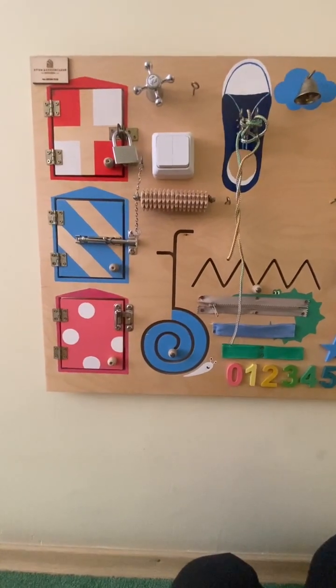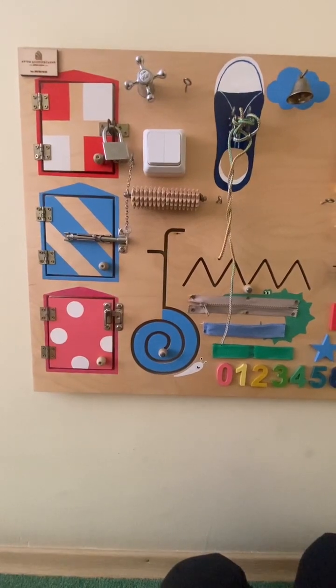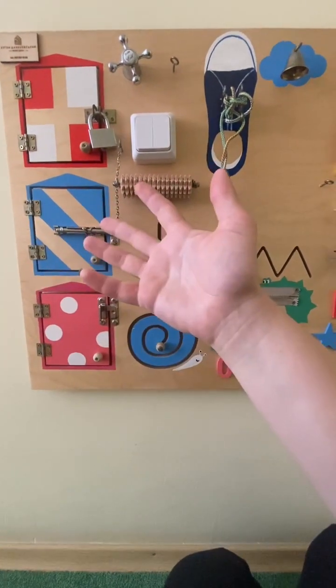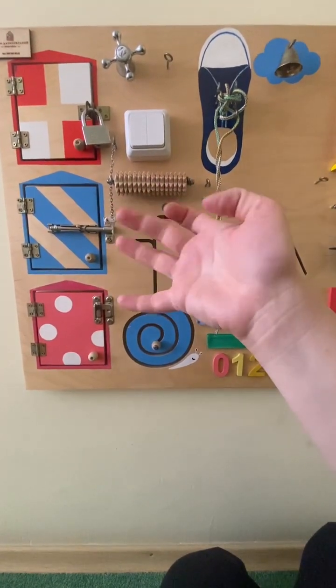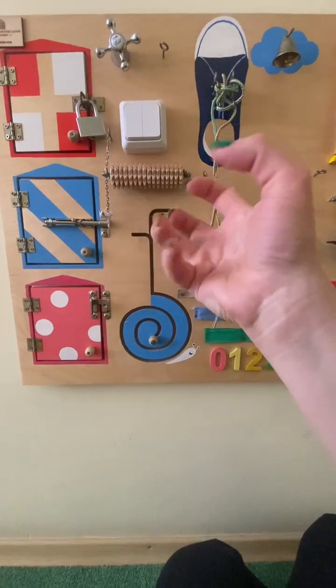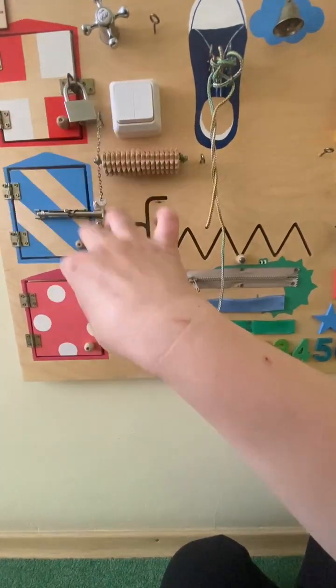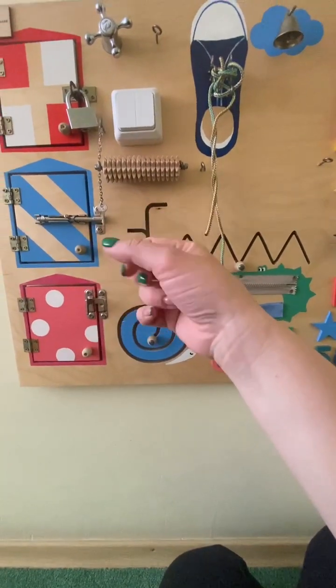This is a busy board for small motor skills of fingers, for work with fingers, after trauma of fingers, nerves, hand, all hand, and contracture.